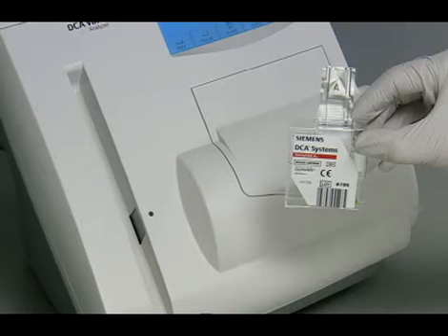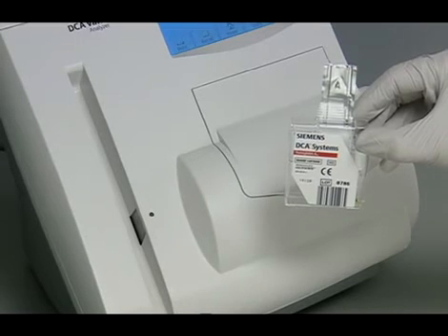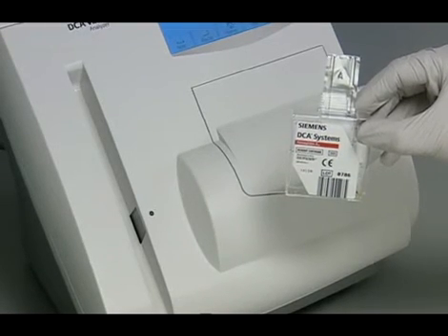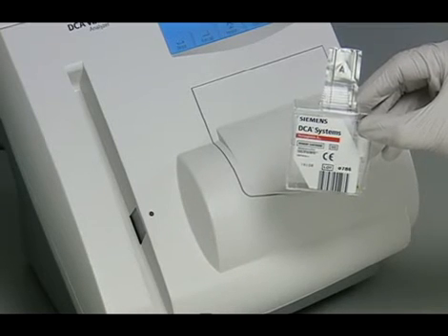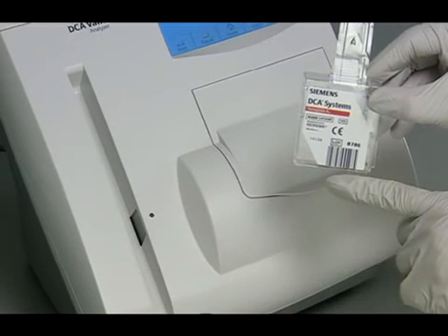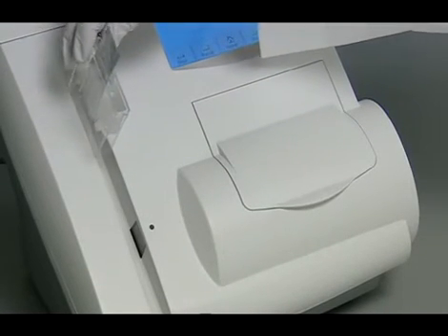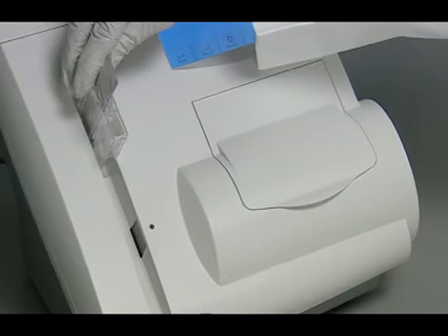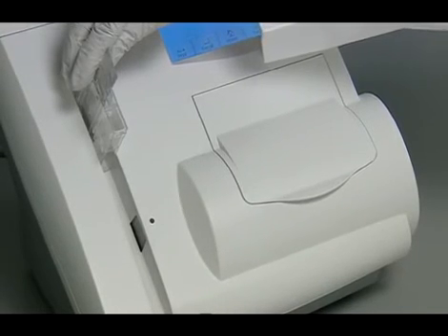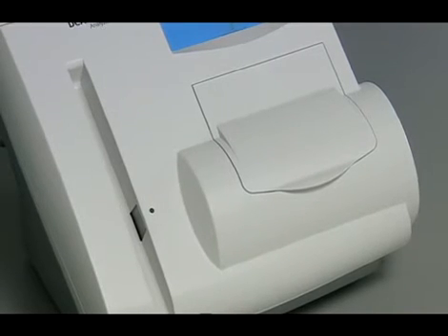The next step is to scan the reagent cartridge so the instrument knows which test and lot number reagent you are using and to check for a valid calibration. Locate the dot on the system next to the barcode track, then locate the barcode on the reagent cartridge. Hold the reagent cartridge so that the barcode faces to the right and insert the reagent cartridge above the dot into the barcode track. Quickly and smoothly slide the reagent cartridge down — a beep sounds to signal a successful scan. Note: if no beep sounds, repeat the procedure.